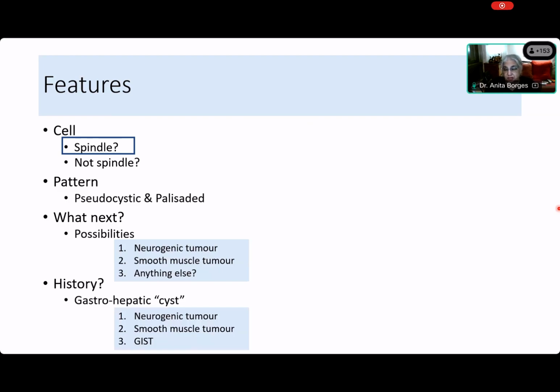Now, which of these three would you want to make an educated guess on, on H&E? Normally, you have a neurogenic tumor like a schwannoma that is palisaded. So are you going to rule a schwannoma out? Yes, palisaded, isn't it? And that also shows you cystic change. That also shows you areas where the cells become vacuolated. So are you ruling it out? Or which of these three are you giving most weightage to?